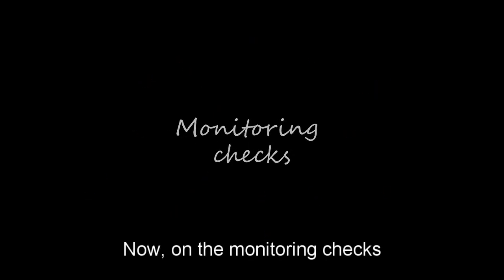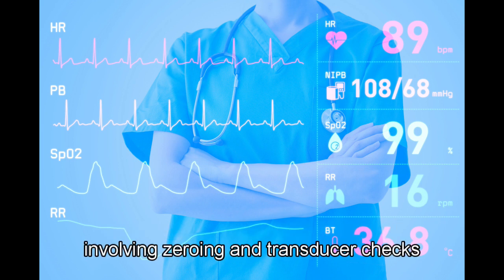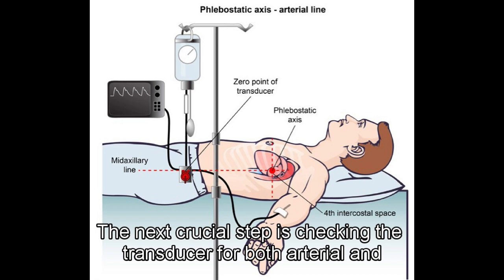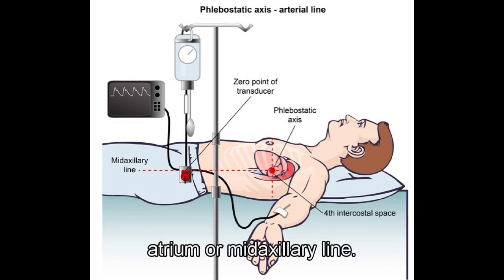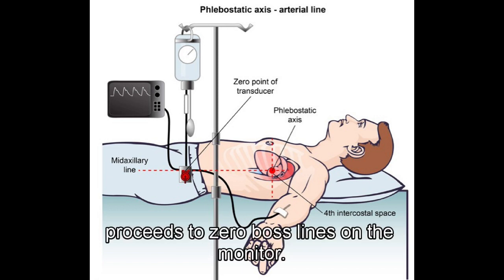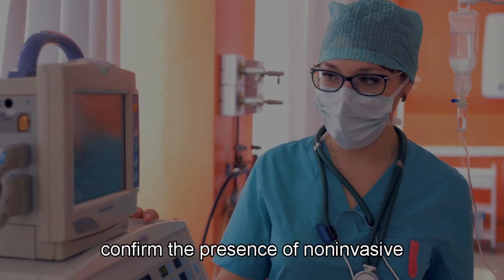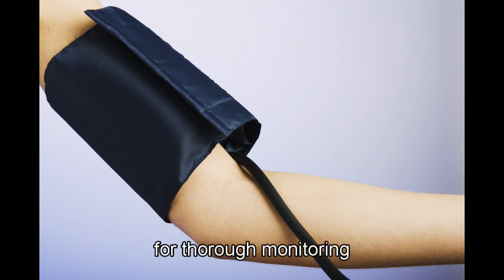Now, on to monitoring checks. Invasive lines are like a synchronized dance involving zeroing and transducer checks. The next crucial step is checking the transducer for both arterial and central venous lines. When dealing with patients lying down, position it at the level of the right atrium or mid-axillary line. Once in position, proceed to zero both lines on the monitor. Additionally, confirm the presence of the non-invasive blood pressure attachment to the monitor for thorough monitoring.